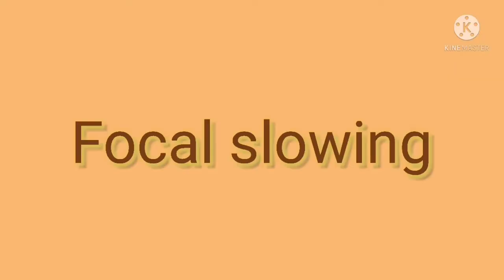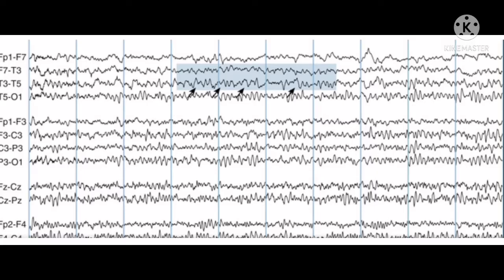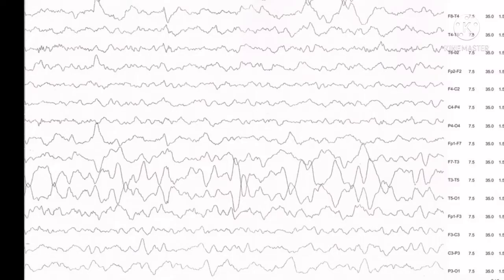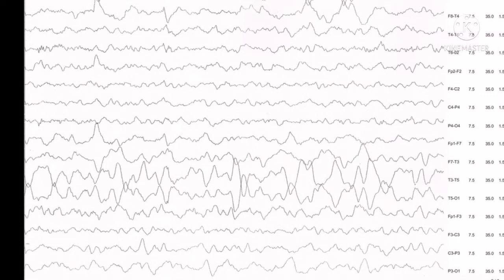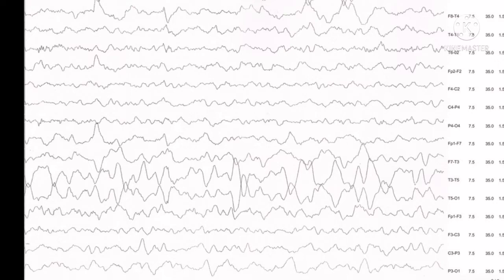Regarding the focal slowing, focal slowing may be rhythmic as that occurs in focal structural lesions or it may be polymorphic. In the delta range, we call this polymorphic delta activity or PDA. This focal slowing is irregular and composed of delta activity with theta activity superimposed. PDA often appears on disorganized EEG background, but the background may be normal in some cases. PDA is most common finding in focal structural lesions such as tumors, contusions, hemorrhage, infarction, and abscesses. The presence of focal spikes or sharp wave without any other disturbance on the background is seldom a sign of focal parenchymal lesion, but the presence of focal spikes on top of PDA is common in structural lesions.